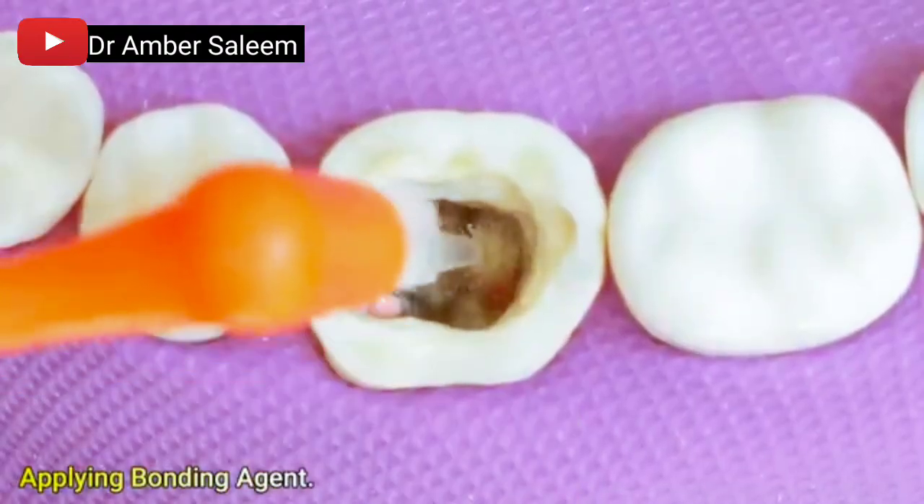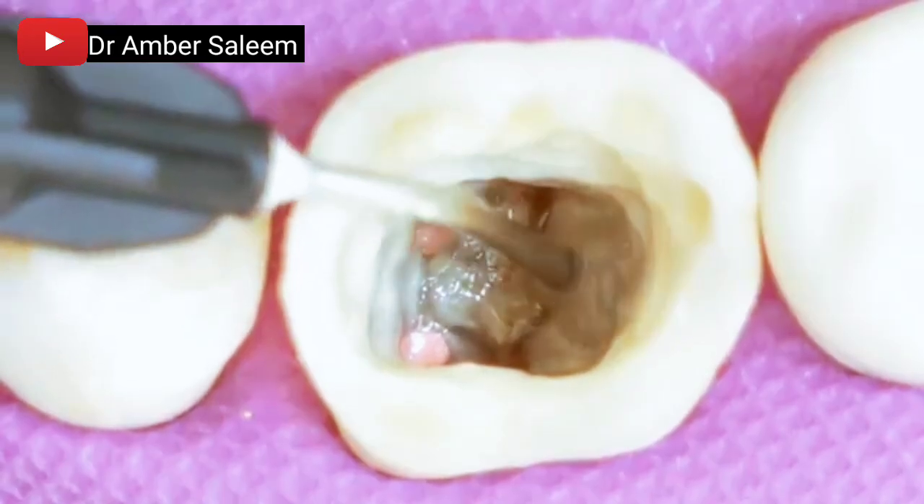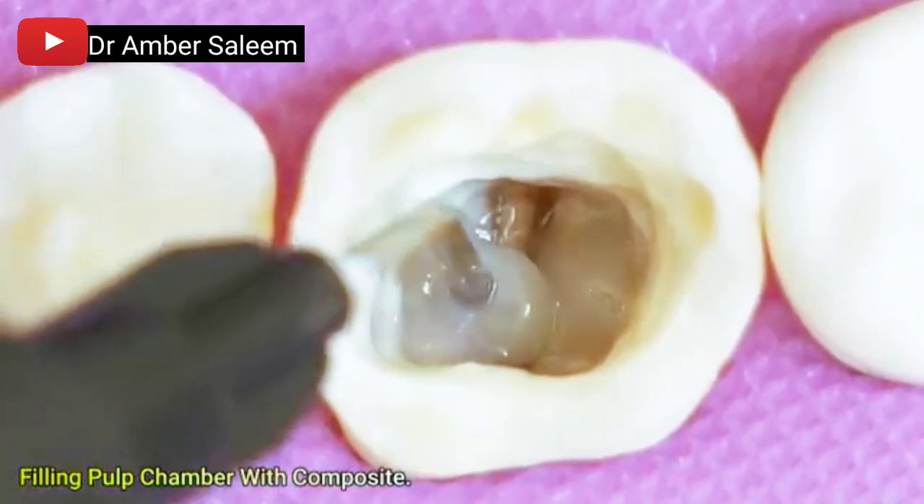Applying bonding agent to the pulp chamber walls. The pulp chamber is then filled with composite resin to provide a coronal seal and foundation for the final restoration.